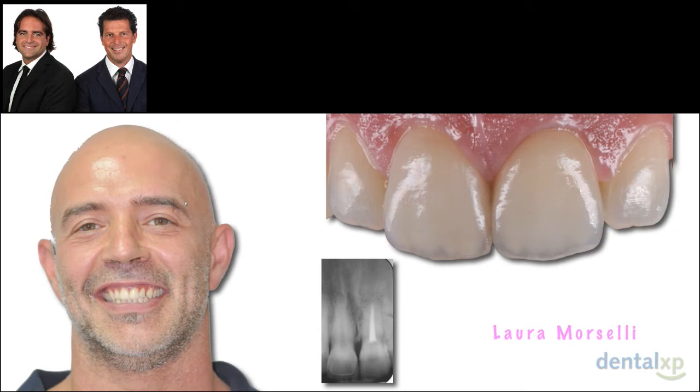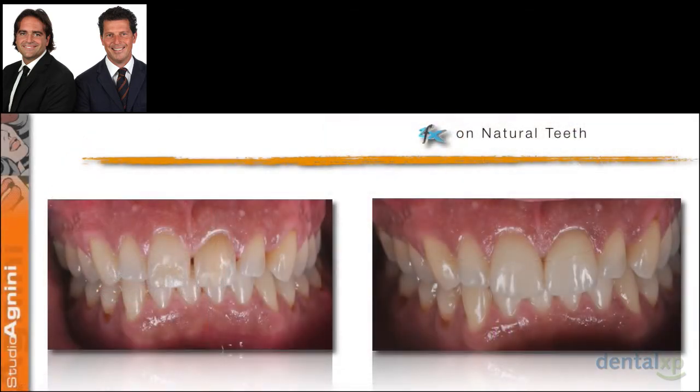You can see the X-ray, you can see the precision of the crowns, and our perception was positive for this first case. And you can see from this before and after that we managed to close the diastema, and we managed to solve all the aesthetic issues that Claudio asked us to treat when he walked into our office.